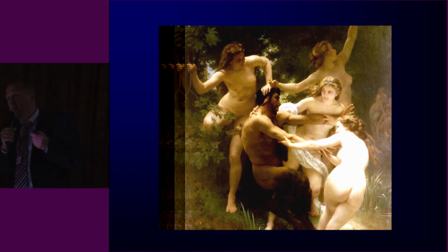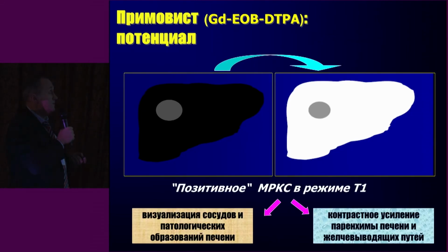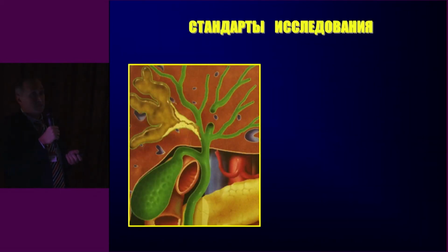So all the same could be done if we use contrasting agents properly. We could have the same result. Contrasting agents improve the parenchymal signal, and they make it possible to better see non-contrast accumulating areas.